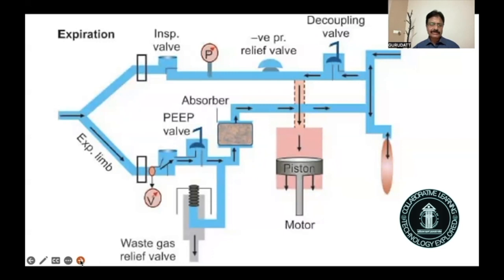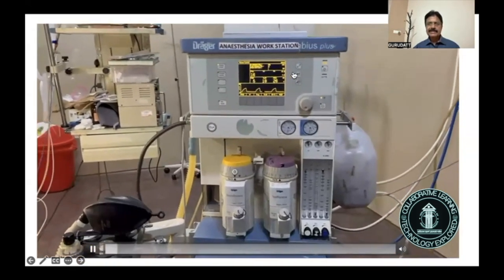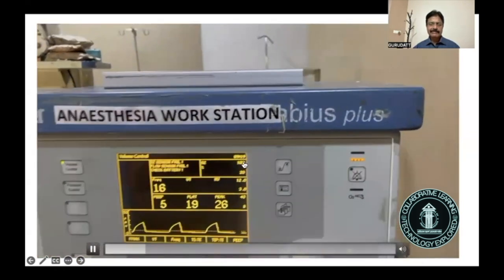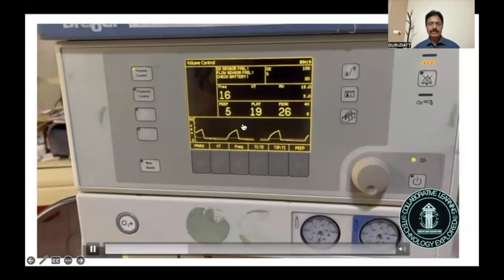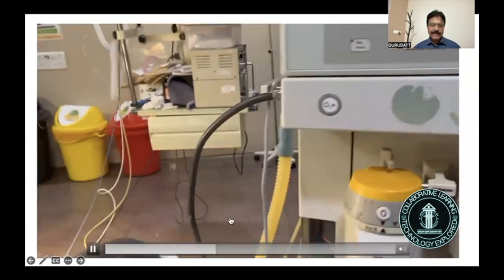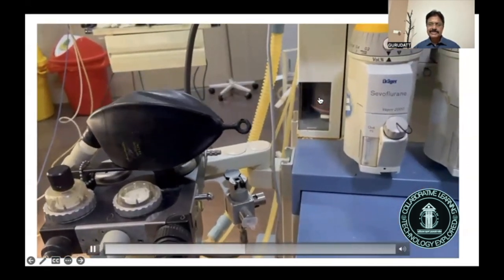And I would like to show you a video wherein you can see the bag inflating and getting deflated. So this is the video. You can see this is the Draeger anesthesia workstation, the Fabius Plus, and the patient is on mechanical ventilation. You can see the ventilator graphics. The patient is on volume controlled ventilation. I want you to focus now on the bag and the piston here.